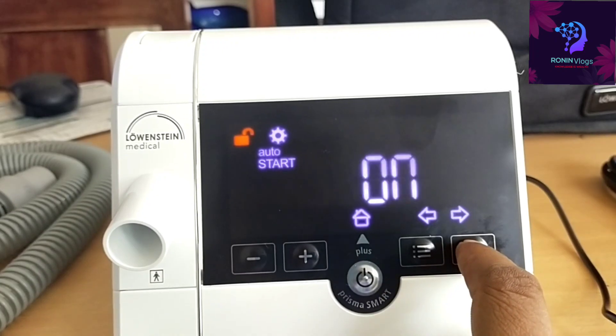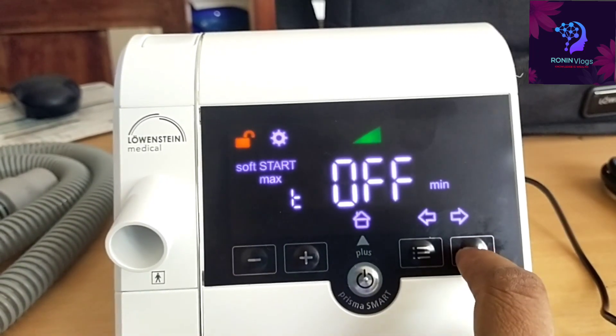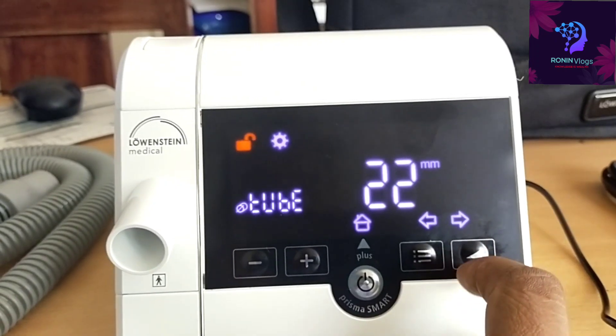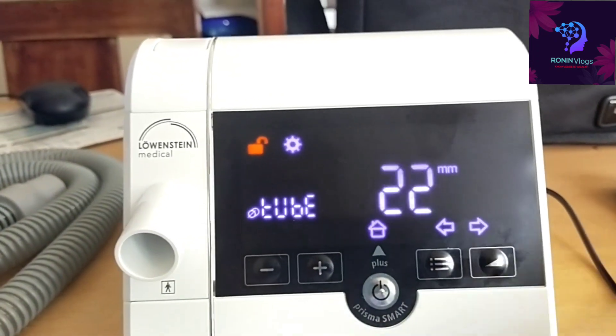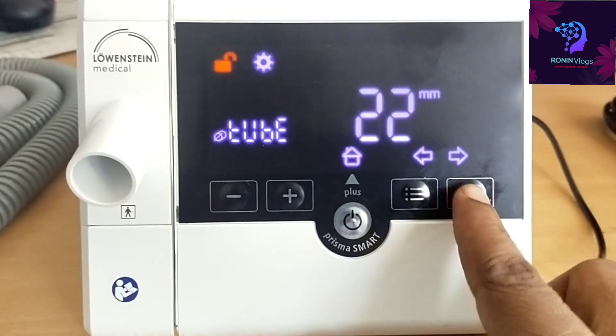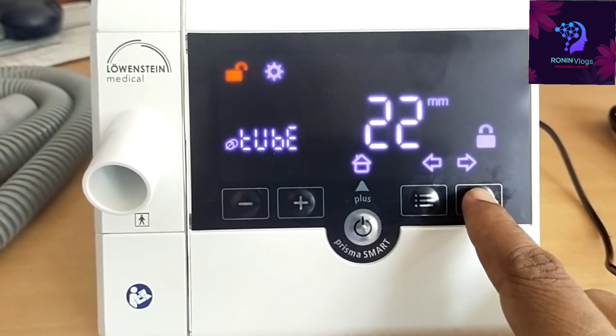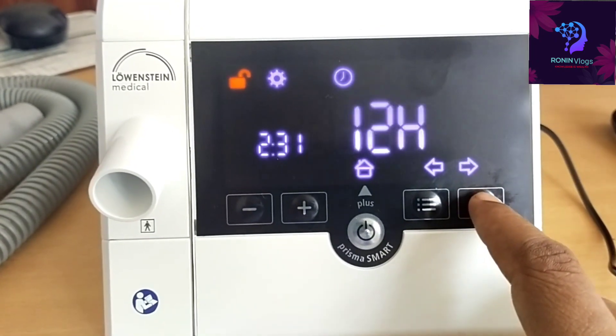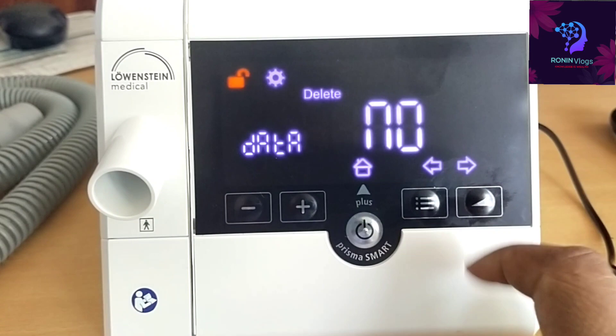For the other settings, no need to change anything — just set how much flow or pressure you need to give. The tube size will always be 22, so no need to do anything there. If we want to change the time settings, we can change that here as well.